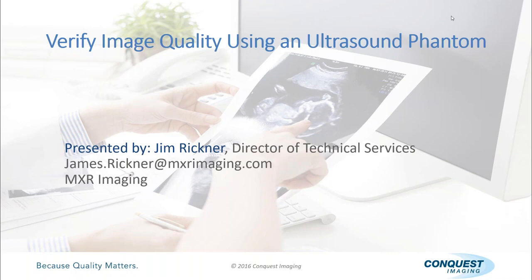Now it's not working. I checked this before I started here, and it was working. So now it's not. Great. I even checked it. I don't know what happened. I can do it manually, but I was hoping not to have to hit buttons.